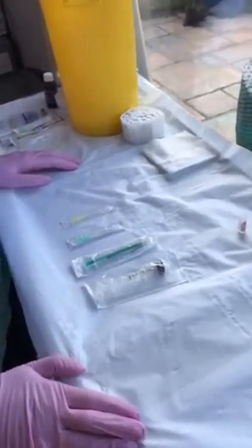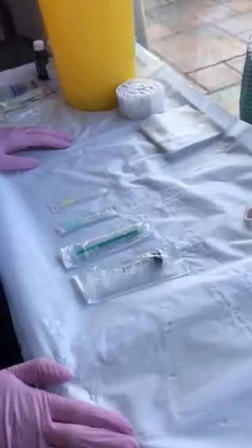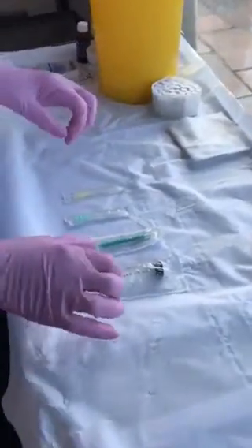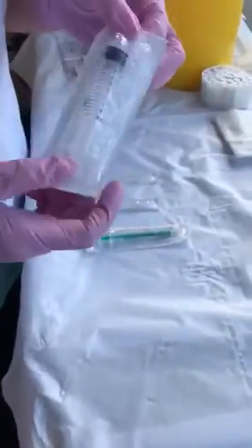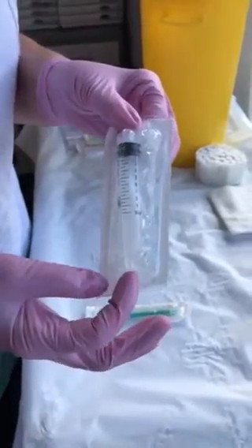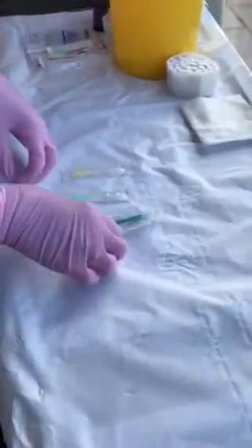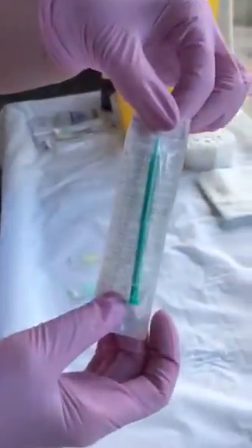Hi everyone, today I'm going to show you how to dilute hyaluronidase with just one mil of saline. Some of the guidelines tell you to do it with a 10 mil syringe, but if you use a 10 mil syringe then obviously there's a lot more pressure on the syringe, plus you're also using up 10 mils of saline. So today we're going to use a 1 mil.